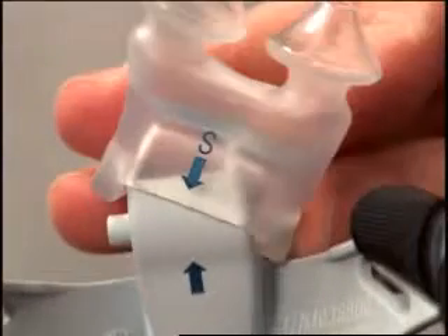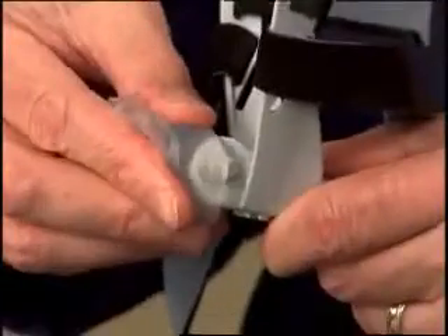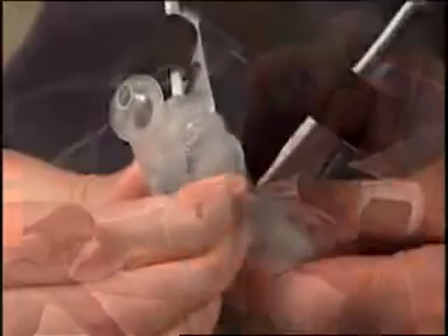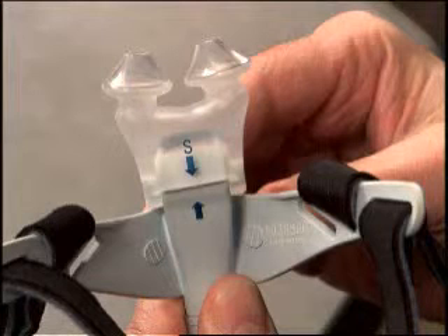Attach the cushion to the hub one side at a time. Place the hole on the side of the cushion over the corresponding post located on the hub. Stretch the cushion over the hub to attach the other side. The cushion will stretch without tearing. When the cushion is attached properly, the arrows on the cushion and the hub will be on the same side.